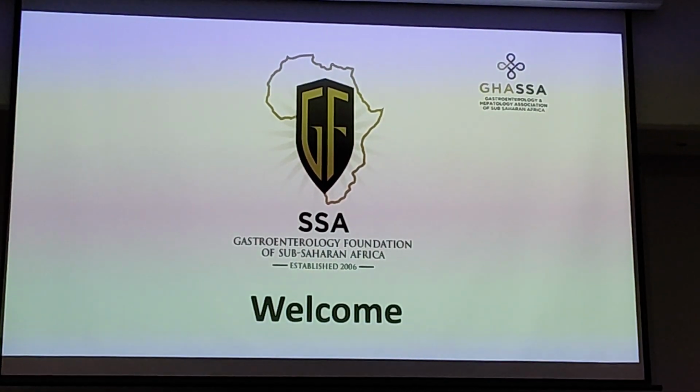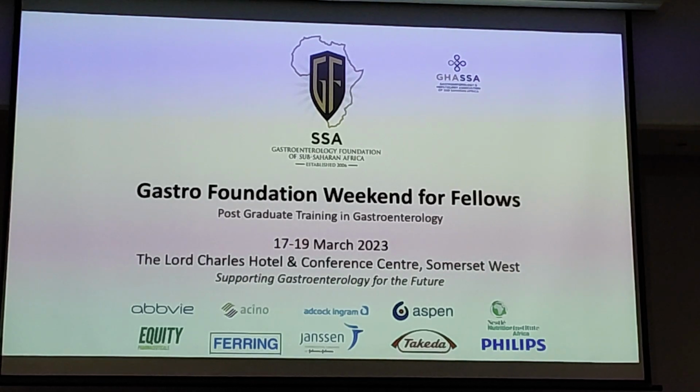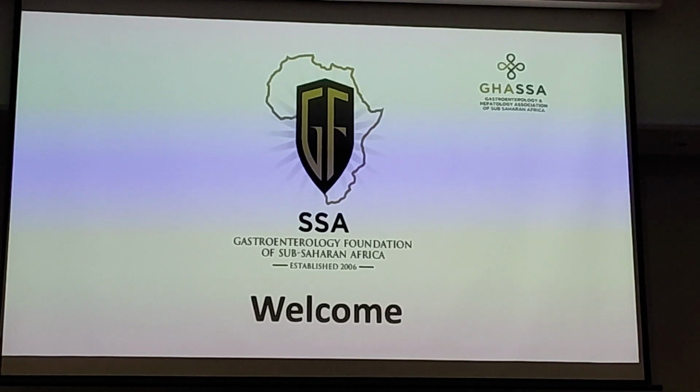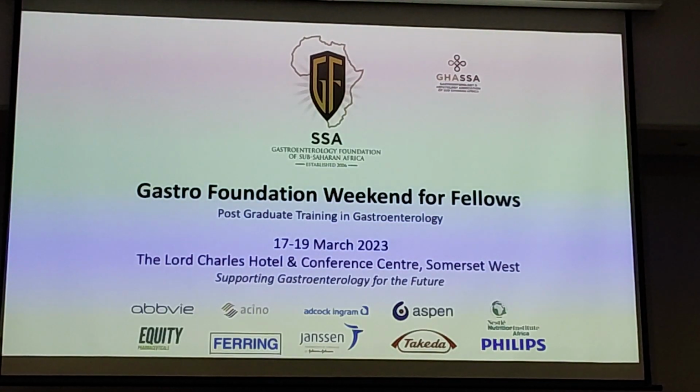Yeah, thanks for that fantastic presentation. I have a background in echocardiography. I've done it for many years. So I have two questions. First is, have you used M-mode to help with measurements of bowel thickness, whether it's UC or Crohn's, whether it helps with the flares, plus M-mode.